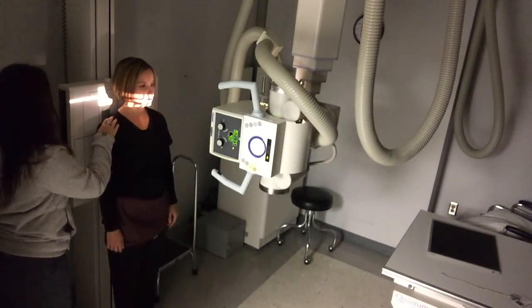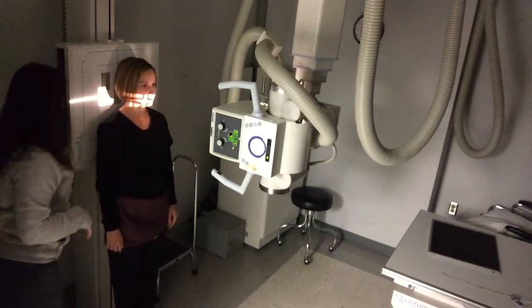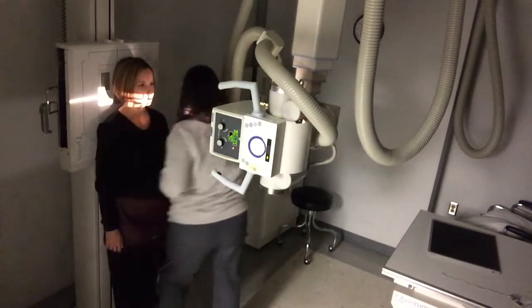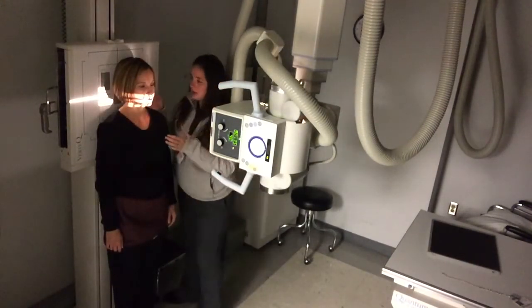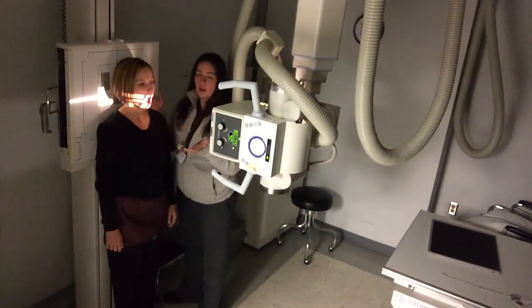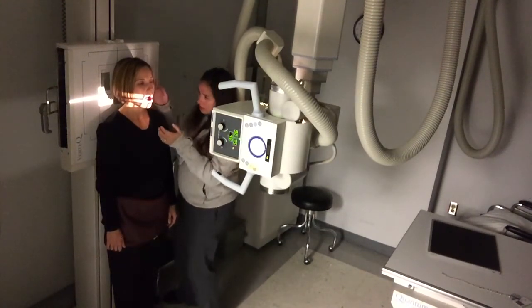And then I'll raise this behind you. I'm going to come right up behind you here. All right, now that I'm kind of in the ballpark, I'm going to start positioning. So for this projection, we are going to have their mouth open. I usually just have them open their mouth comfortably at first, so that way they're not stressing their jaw throughout the entire exam. So just kind of have them open their mouth a little bit first.